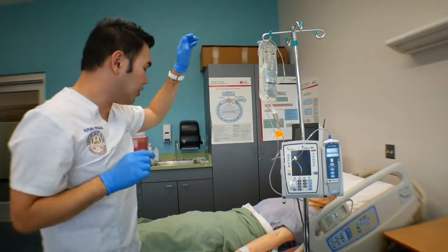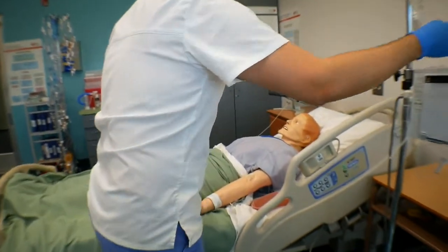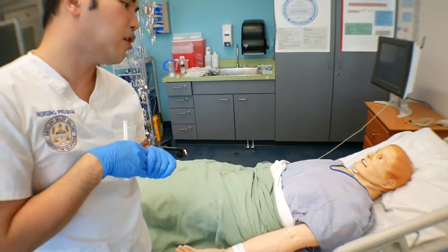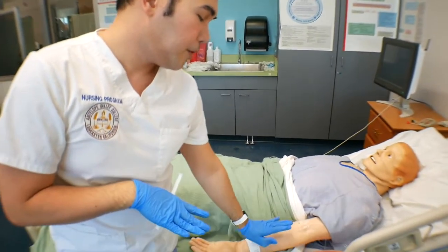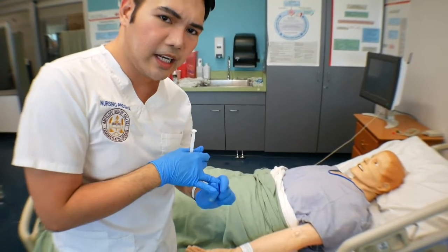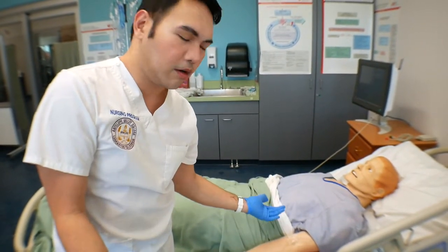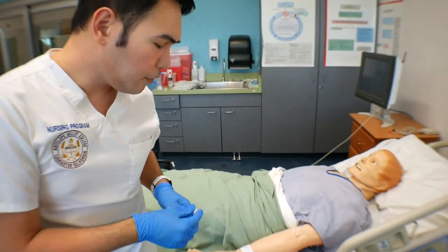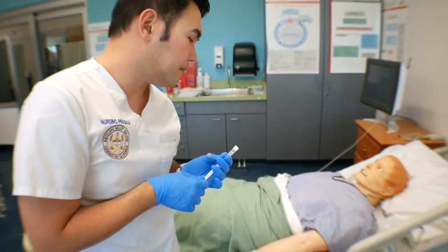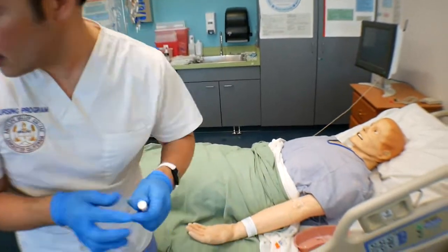Now we're going to the patient. We're gonna go to Mr. Smith. Hey, Mr. Smith, we're here. We're gonna go ahead and infuse your normal saline. So you're going to check the IV site for inflammation, for redness, for infiltration, for phlebitis, or anything that's abnormal. For you to do that, we're going to go ahead and have a flush to check patency of both Y sites. It's going to be your Y sites.